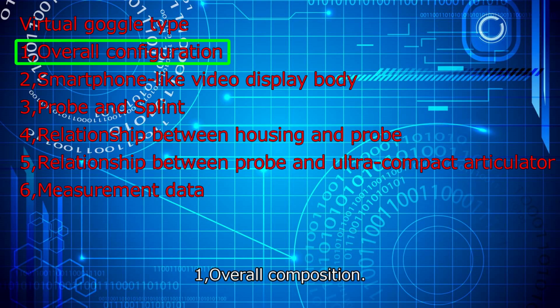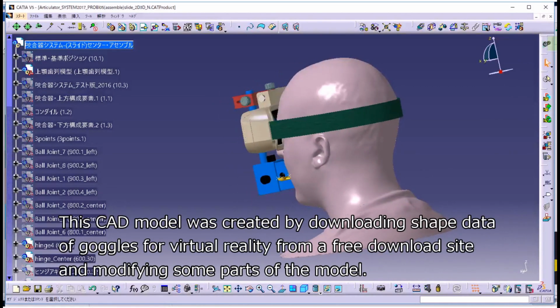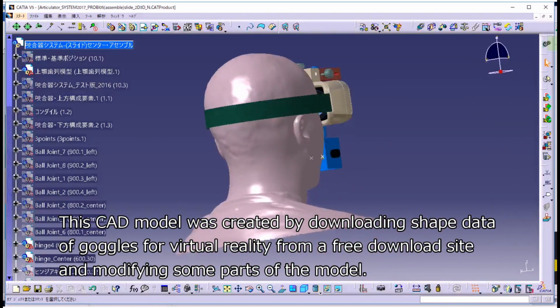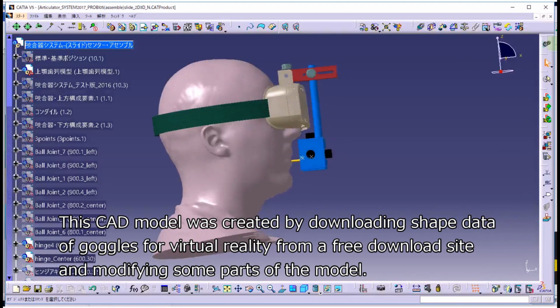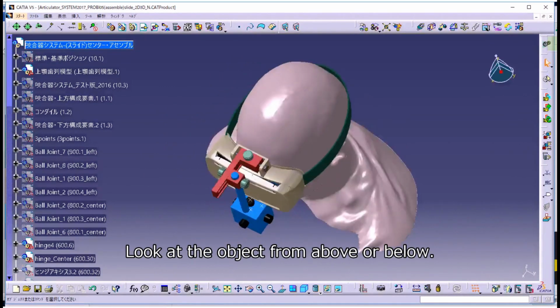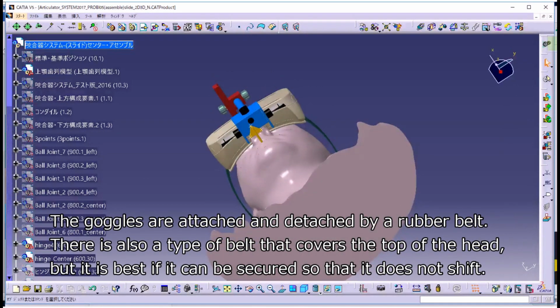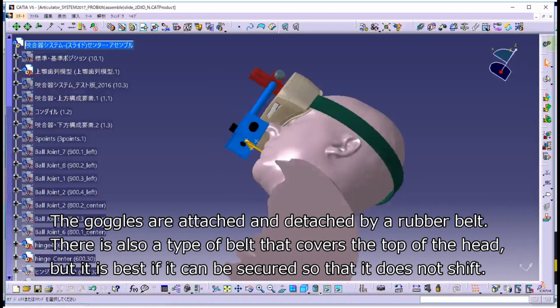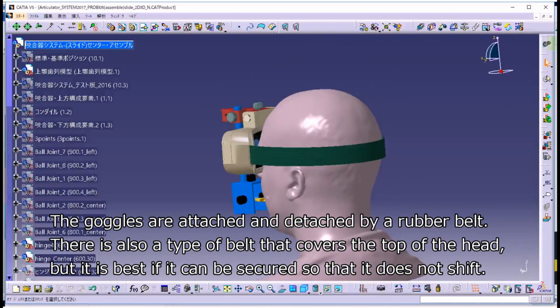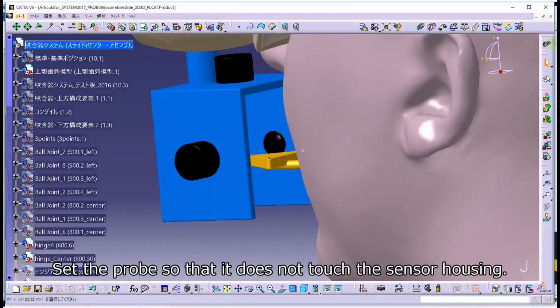1. Overall composition. Overall view of the headset. This CAD model was created by downloading shape data of goggles for virtual reality from a free download site and modifying some parts of the model. Look at the object from above or below. The goggles are attached and detached by a rubber belt. There is also a type of belt that covers the top of the head, but it is best if it can be secured so that it does not shift. Set the probe so that it does not touch the sensor housing.